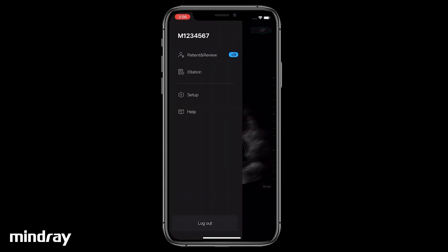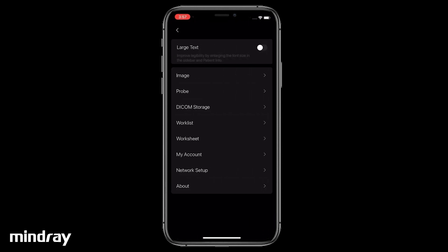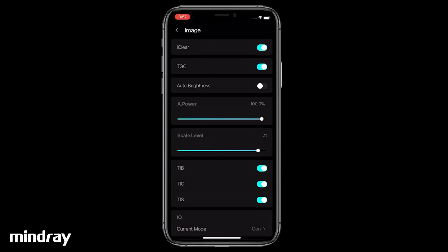Tap the System Tools button, then Setup, and Image for more parameters. Drag the scale level bar to adjust the color scale.